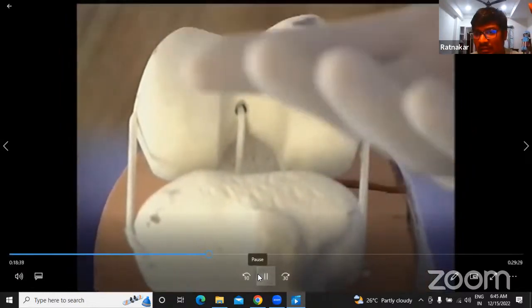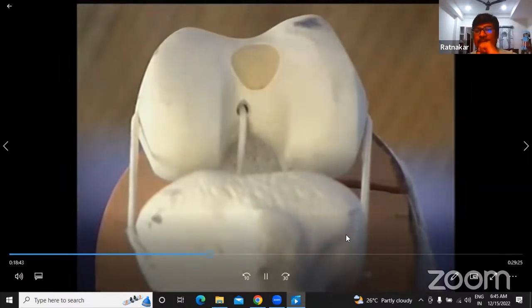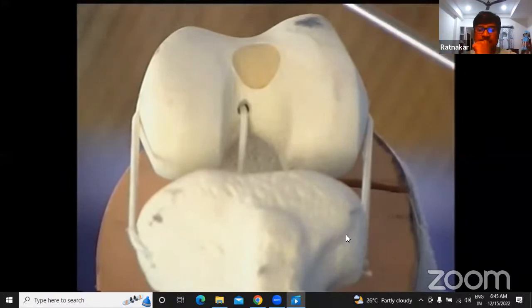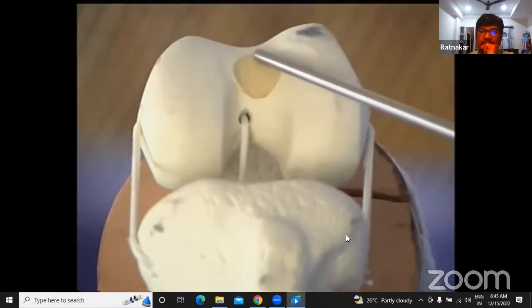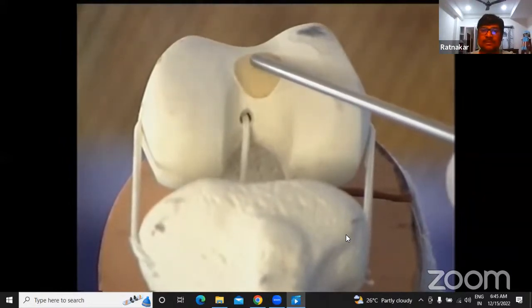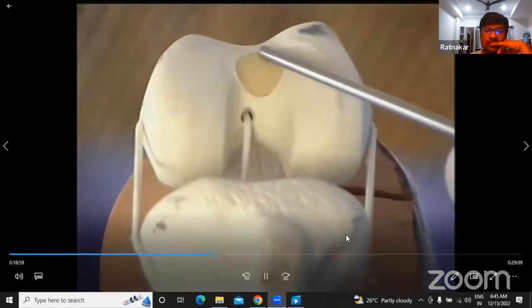The femur first, or tibia first, is entirely a subject of preference. So the first step is to make an intramedullary entry hole for the instrumentation. And this is a very crucial step because this is going to dictate the further steps.